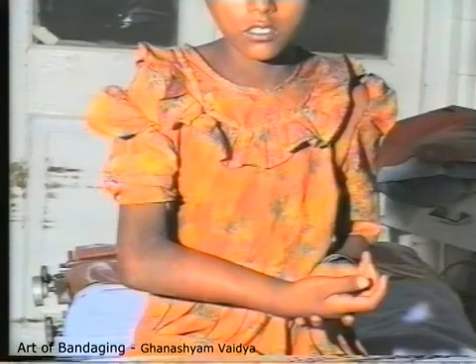Bandages are used to immobilize a fractured or contused part alone or with wooden splints or plaster slabs. This girl has a fracture of forearm bones, and a temporary support is given by a bandage and splint, and another bandage hangs it to the neck as a sling. A tight bandage over a limb is often used to control hemorrhage. See this bleeding surface over the left thigh, and note how a tight bandage is given, rolled tightly to control the bleeding.